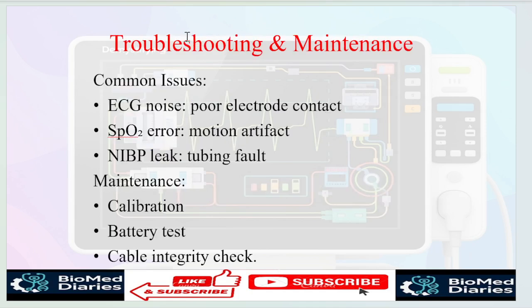So these are the troubleshooting points. Biomedical engineers or technicians are employed in hospitals for maintenance, preventive maintenance, and troubleshooting of the patient monitor. The common issue we face as biomedical engineers is ECG noise. There is poor electrode contact. When there is less contact, or when we didn't apply the gel on the ECG electrode placed on the patient's chest, there will be poor electrode conductivity, so the ECG noise will be there.